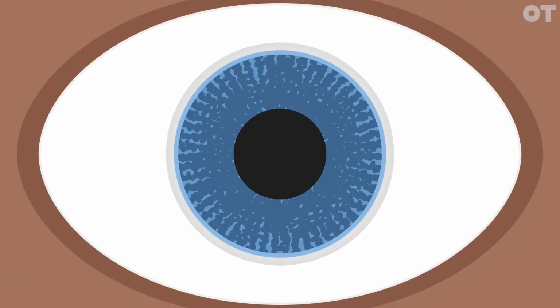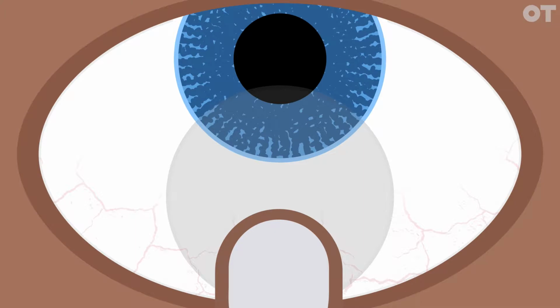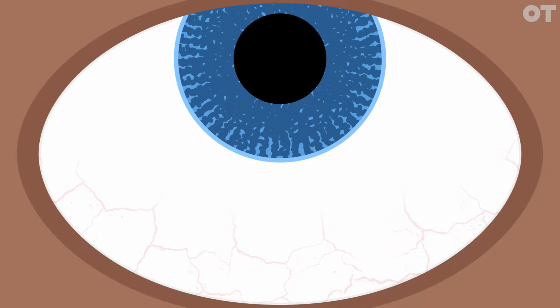When I teach removal, it's a few different techniques and it depends on the patient. So if they've got a really wide eye, then when they open their eyes, they've got lots of white of the eye down the bottom and you've got all that room to play with. You want to slide the lens down off the cornea so that when they pinch, they're not pinching the cornea, because that will really make them jump and it'll hurt and it's not safe. So we need to get that lens onto the white of the eye first, onto the sclera, and then you can pinch with the thumb and forefinger.